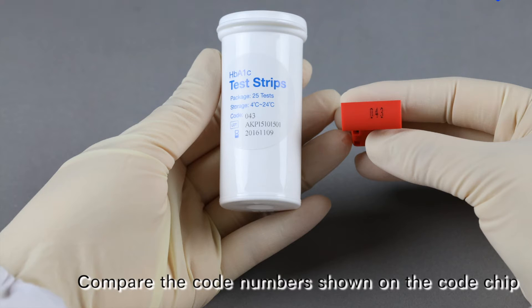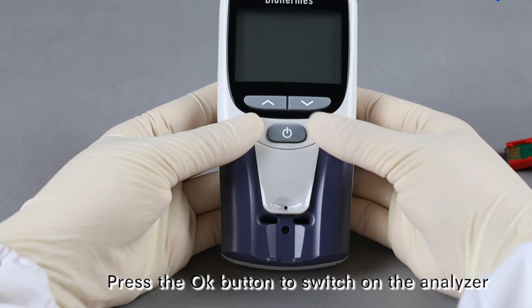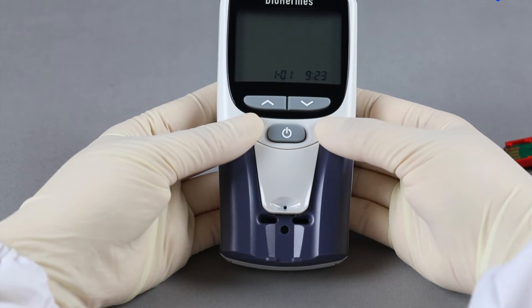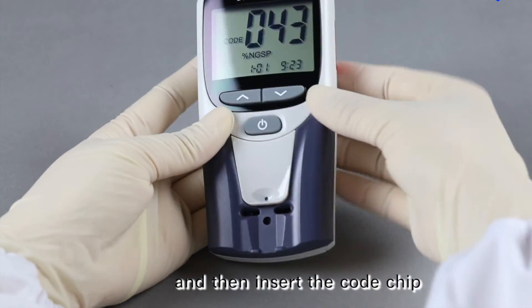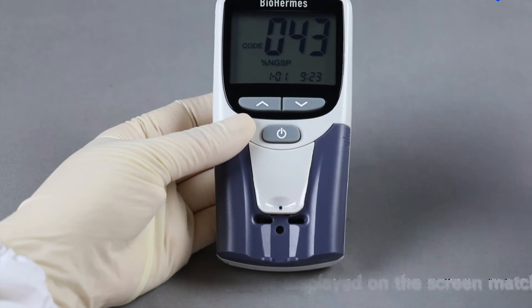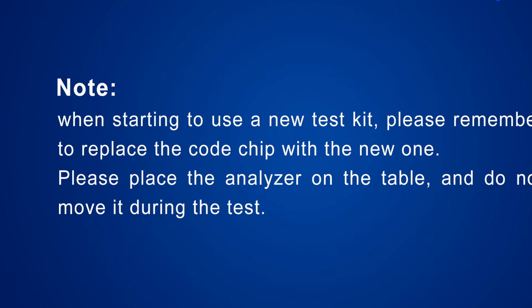Compare the code number shown on the code chip and the test strip file. Make sure the code numbers match each other. Press the OK button to switch on the analyzer. When prompted, insert the code chip and make sure the code number displayed on the screen matches that on the strip file. Note: when starting to use a new test kit, remember to replace the code chip with the new one. Please place the analyzer on the table and do not move it during the test.